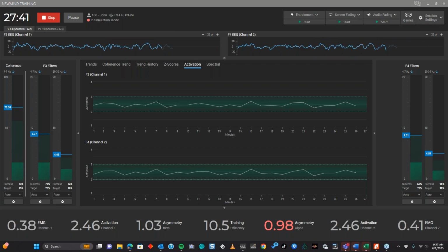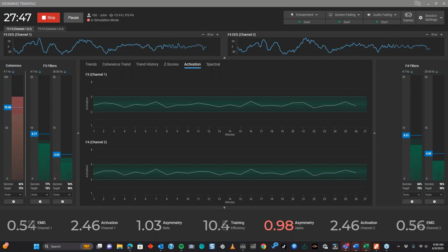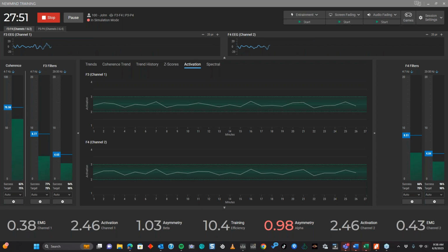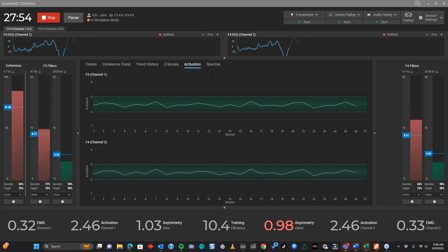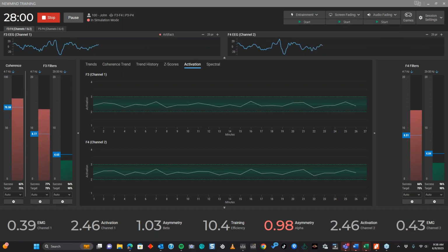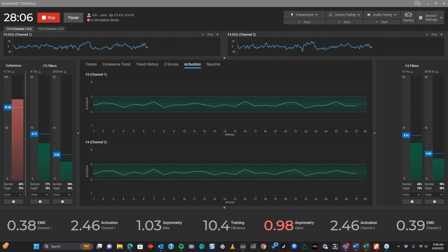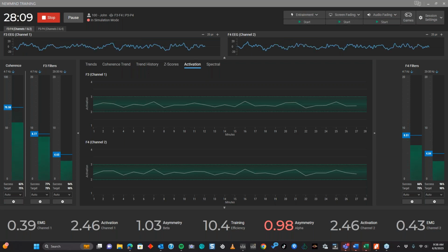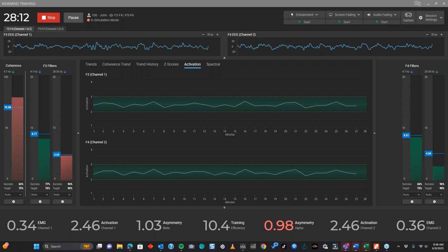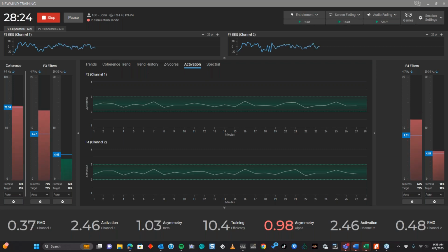There was talk about kids, and keeping in mind the chairs you have, because I've seen where, when training a little kid whose feet aren't touching the floor, the kid will start swinging his feet a little bit, and that transfers up the body, and you'll pick up EMG for that. So for those of you that work with a lot of kids, if you don't have a footstool for them, I highly suggest getting something so all their appendages are firmly planted on solid ground, on armrests, footstools, because that's going to go a long way in your client's training.